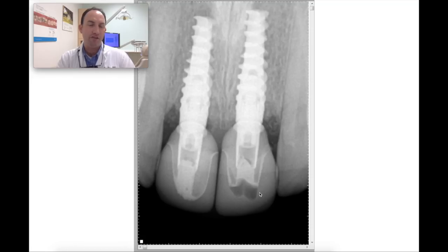If there's any color change, we will replace that crown for him. I don't think there will be. It's an LT EMAX. The blocks are LT, so I don't think anything will show through, but if there is any color change or if he wants to replace it for any reason, then I'll do that for him. It's no problem. You know, I think we'd have to cut the crown off, which is why I'm saying that. There's no way to retrieve that crown without destroying the crown, and I'd rather destroy the crown than destroy the abutment and the crown. So that's the post-op.